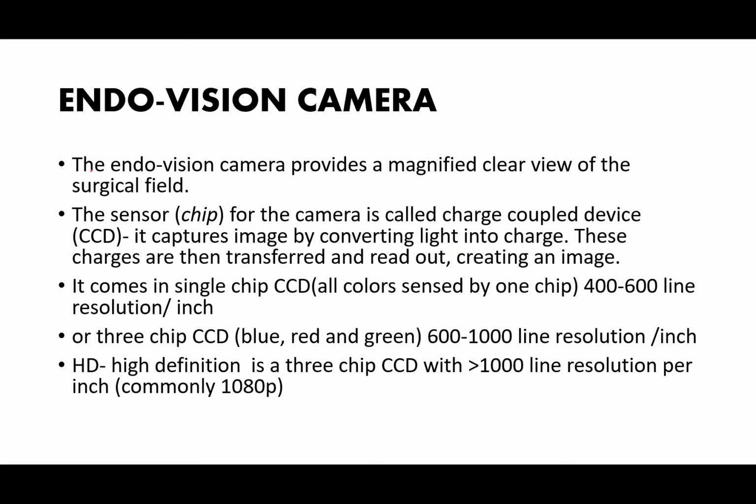So that is the first imaging device, which is the telescope. Now, this telescope is connected to a camera so that it can be viewed on the monitor, the video monitor. Now, the camera system of a laparoscopic setup has two components: the endovision camera and the camera head.